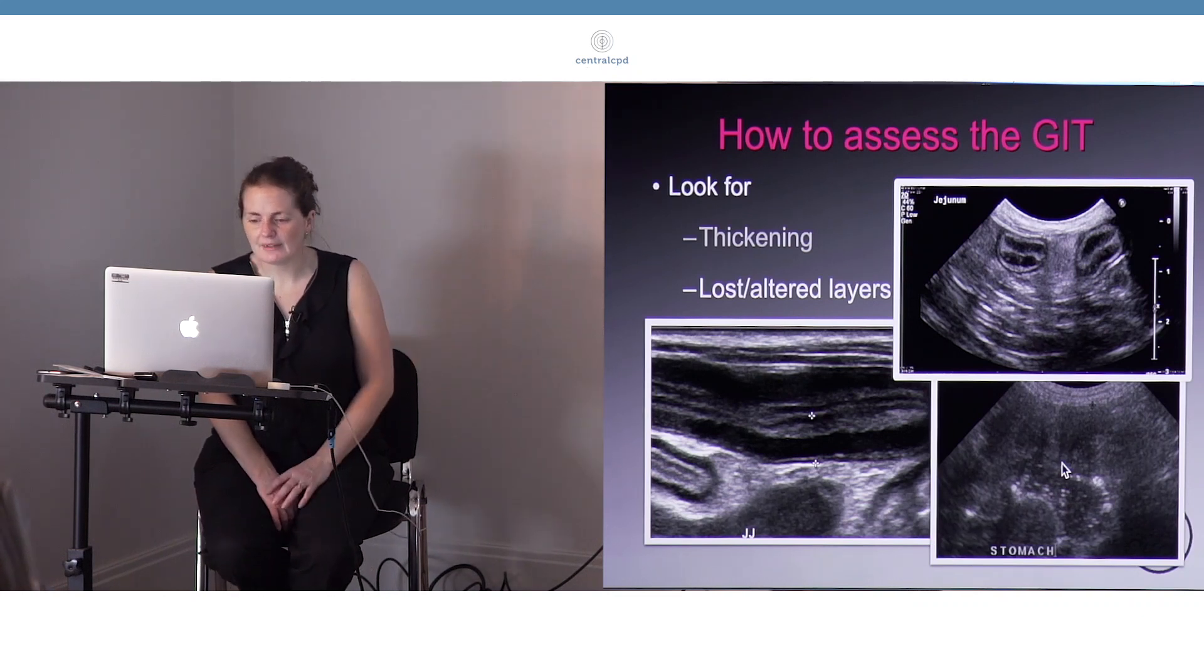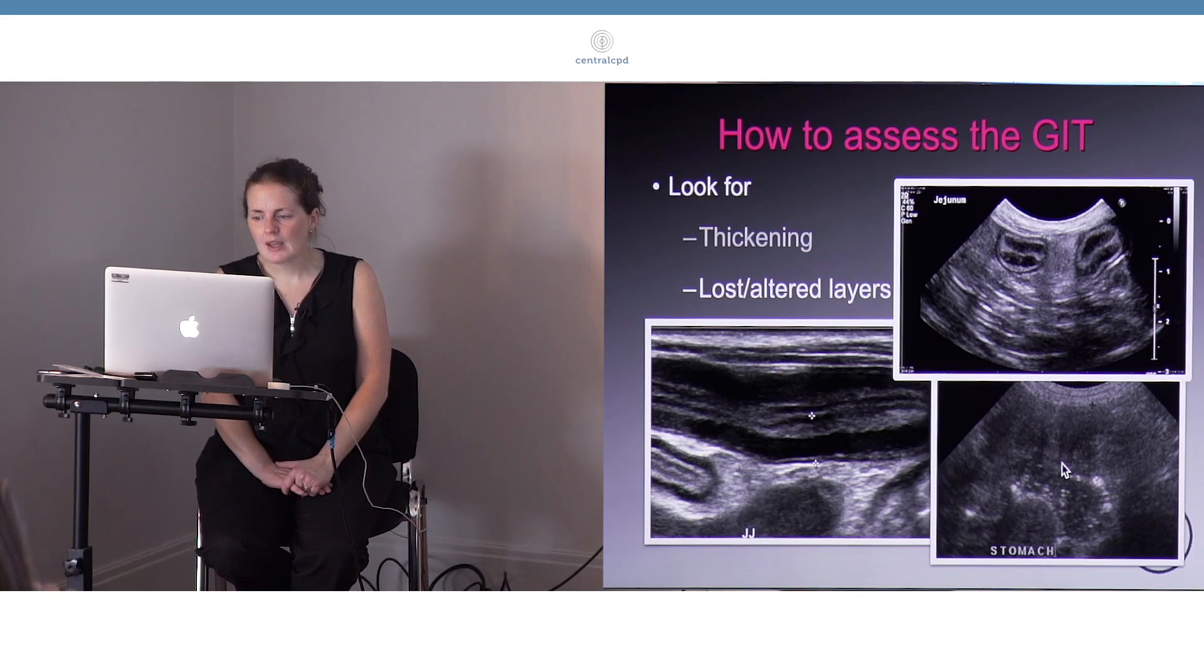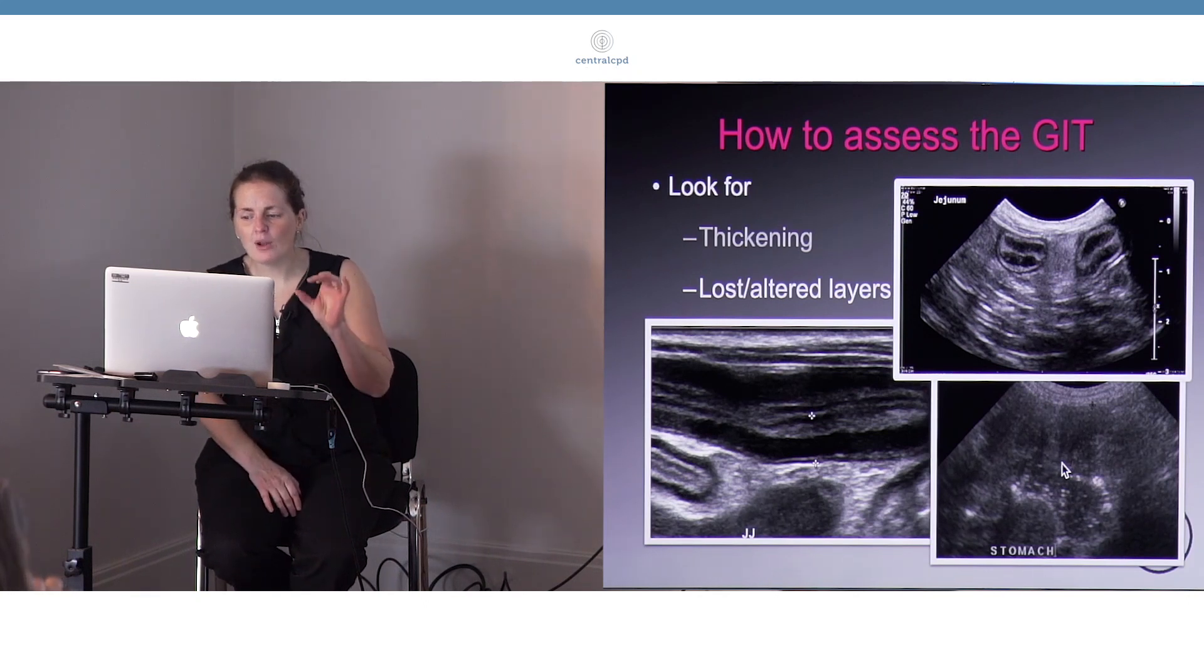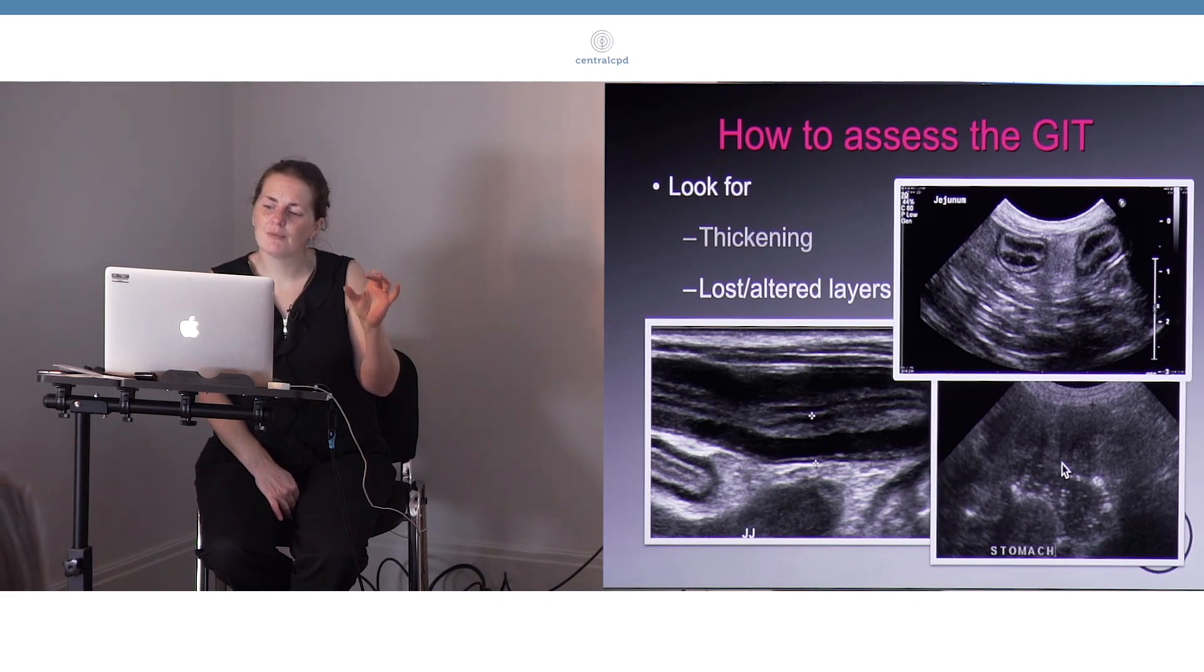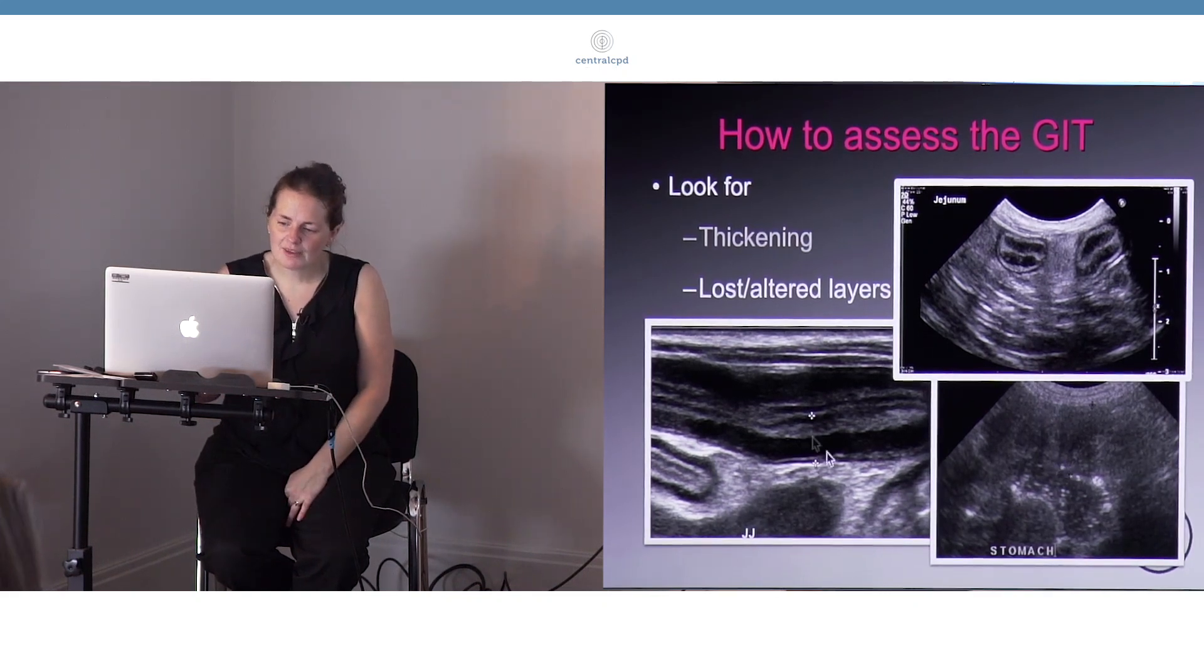Still need your FNAs to confirm it, will be a worrying feature. However, beyond looking for loss of layering and presence of layering, we can actually look at the layers themselves. For a start, when we look at this piece of bowel here, we can see that actually this is the lumen, this linear structure right at the center of the bowel.